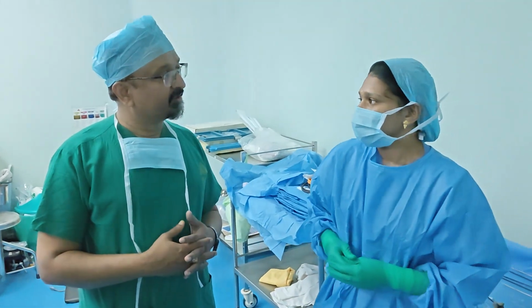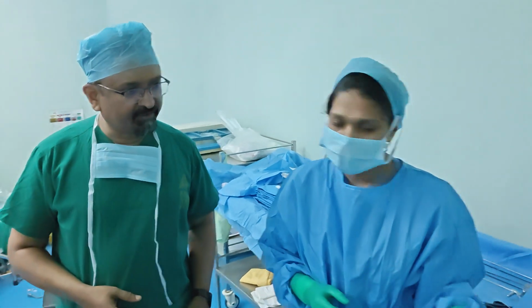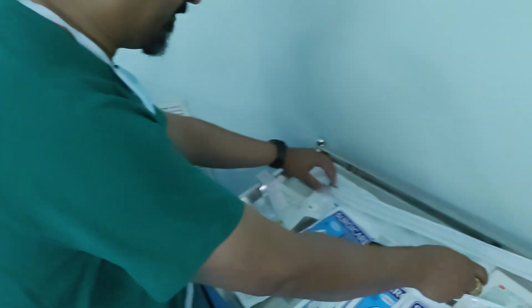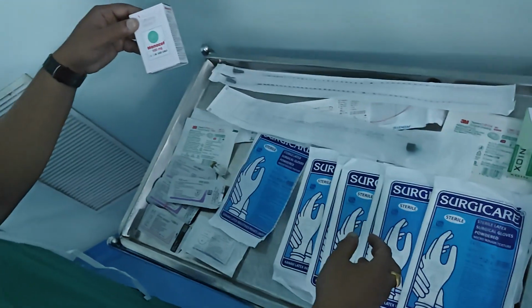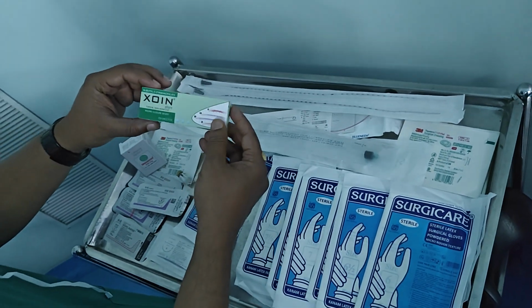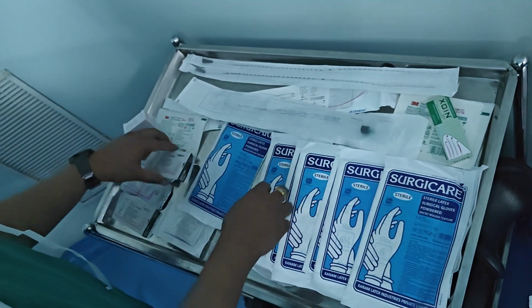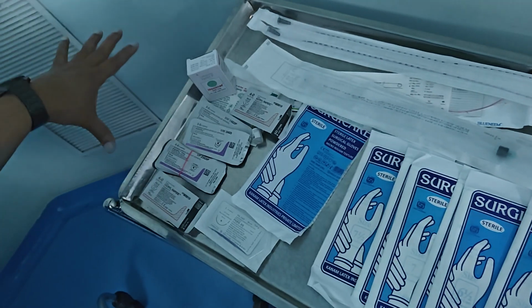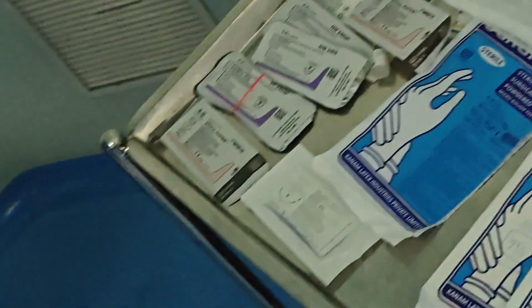What about the antibiotics? Yes, we can have antibiotics also. Sir, I think we have the antibiotic here. Before the injection, cefotaxime is there. Then what else do we have here? So we have a lot of feeding tubes here. We have the Foley catheter. We have the antibiotic. Then we have this tissue sealant. At the end, a 3 mm port can be closed with this. We also have various suture materials, one size above and below. All suture materials are there. This is for skin closure. So that is a complete setup.